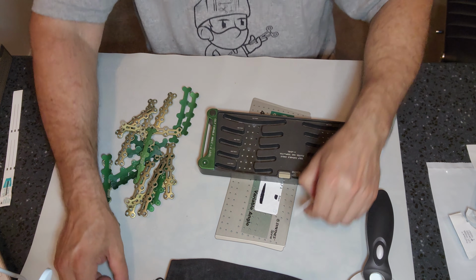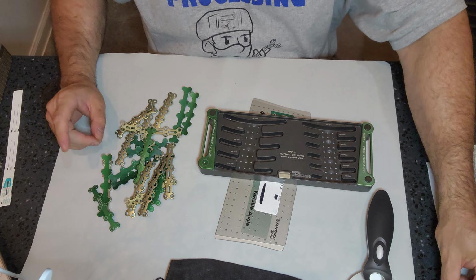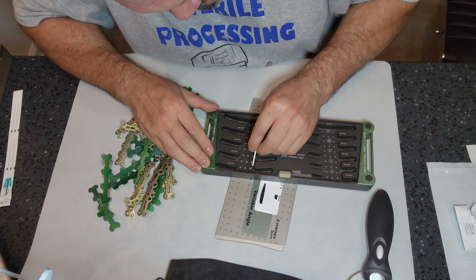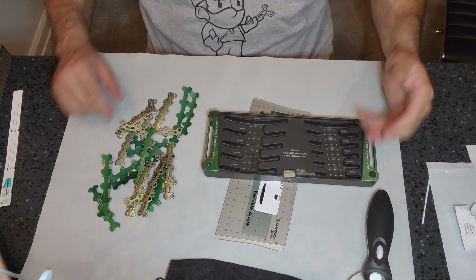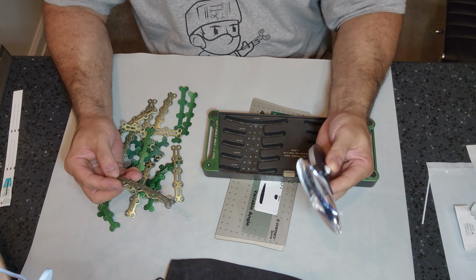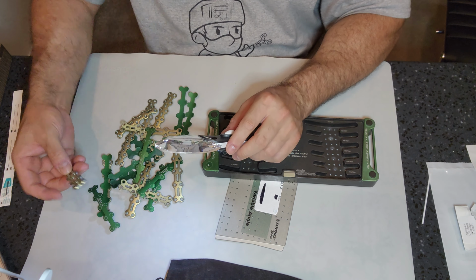So I'm just showing you some of the quality checks that we can do if we're in doubt of what we're seeing. But let's say that little piece ain't there. We're going to scrape that off, right? We're going to scrape that off and pretend that that's not in there. So what are we doing with our instrumentation? Well, we're using our lighted magnification and inspecting our instruments for the same cleanliness.